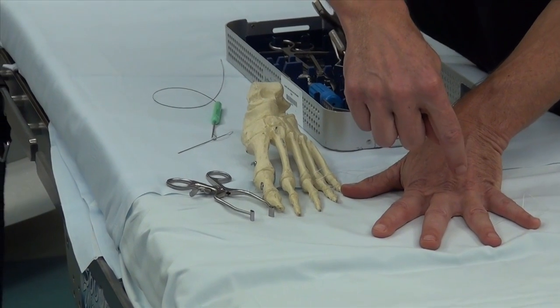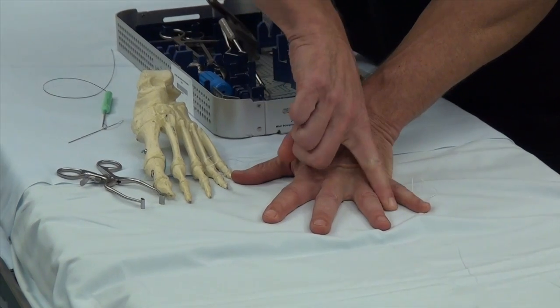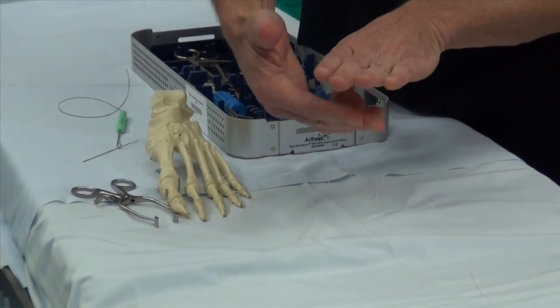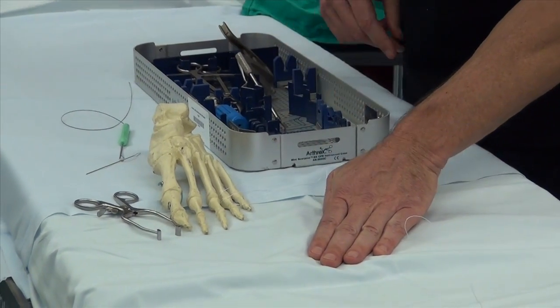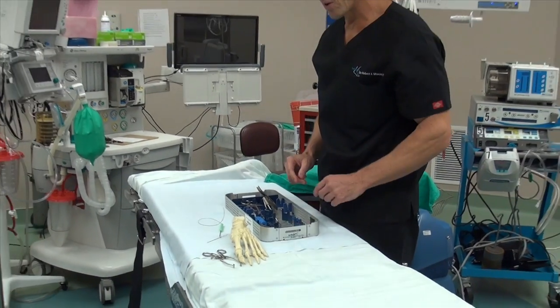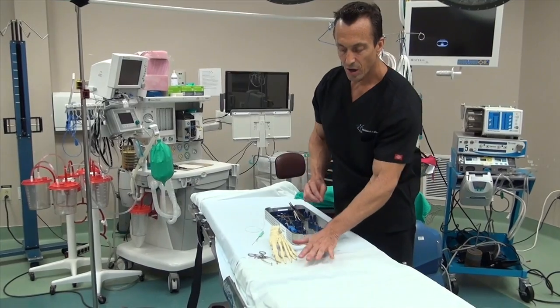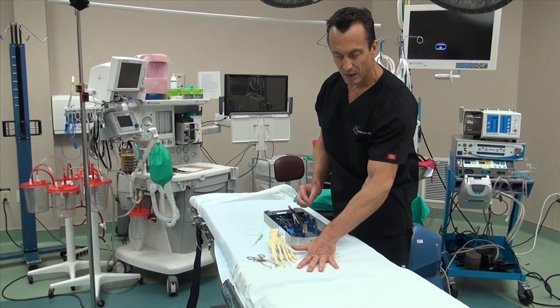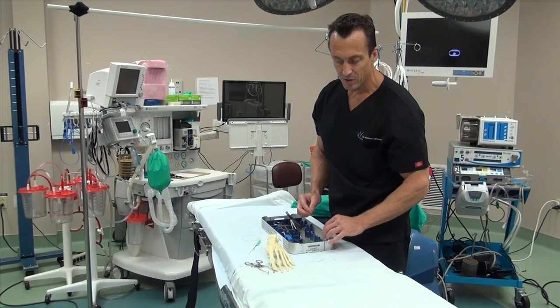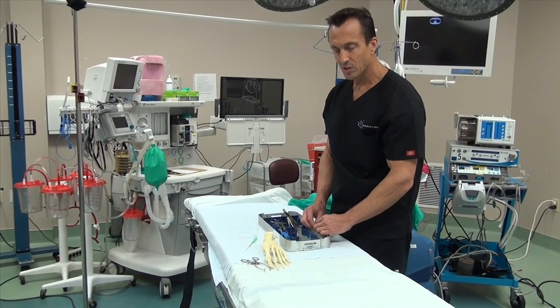The suture was down here, we tied up, drilled a hole, and when we tied this together it swung the toe over, loaded the foot — and when the foot was spreading out it was normal. It came out great, not only function-wise but cosmetically. So there's another indication for the plantar plate repair, which is the splaying of toes you can see in a lot of women's sandals and open-toed shoes. Great new indication. I would recommend the set — let's go watch the surgery.